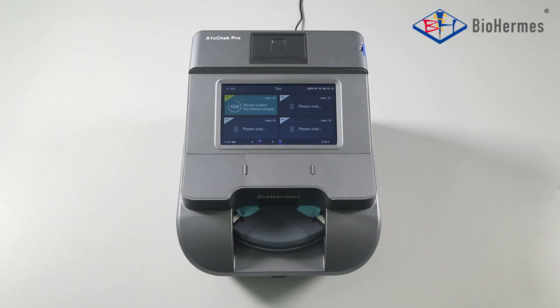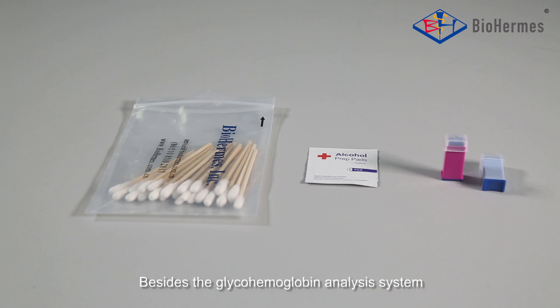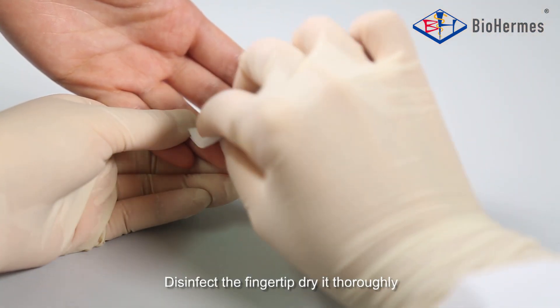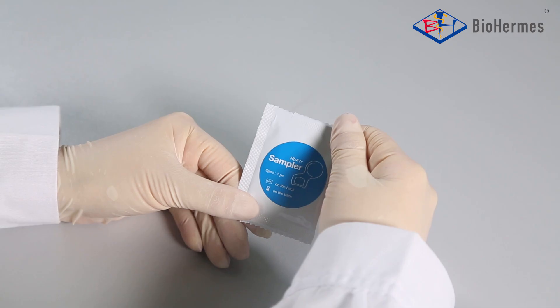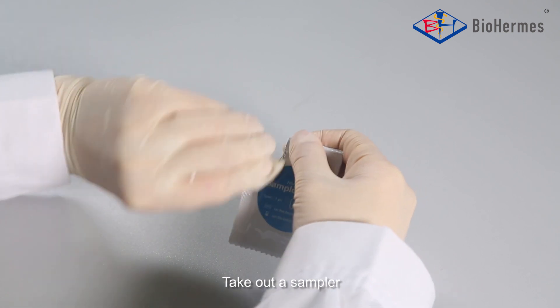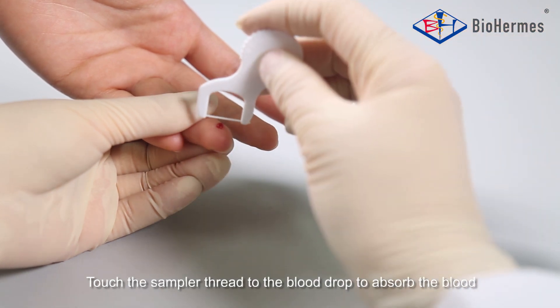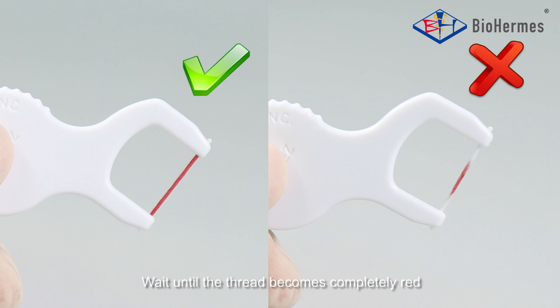Blood Sampling — Capillary blood: Besides the glycohemoglobin analysis system, a cotton swab, alcohol swab, and lancet are also needed. Disinfect the fingertip and dry it thoroughly. Prick the fingertip with the lancet. Take out a sampler and touch the sampler thread to the blood drop to absorb the blood. Wait until the thread becomes completely red.